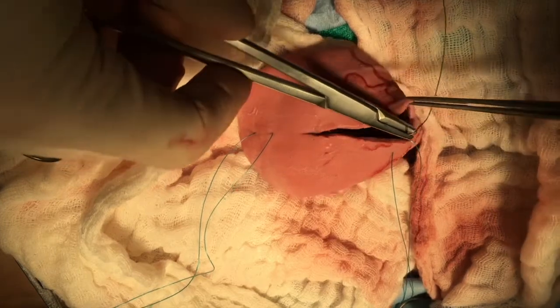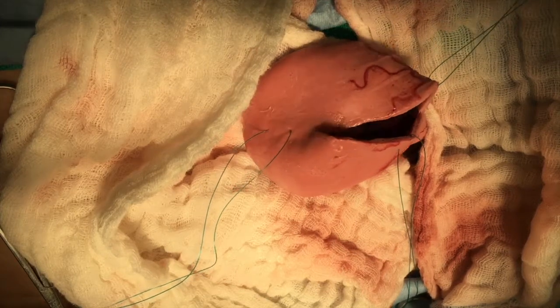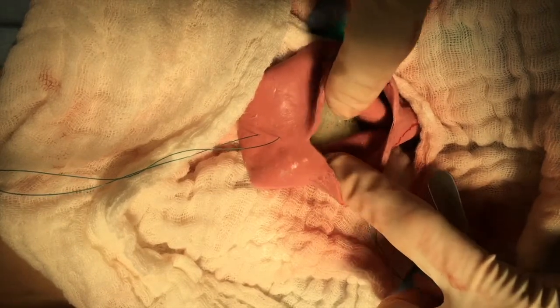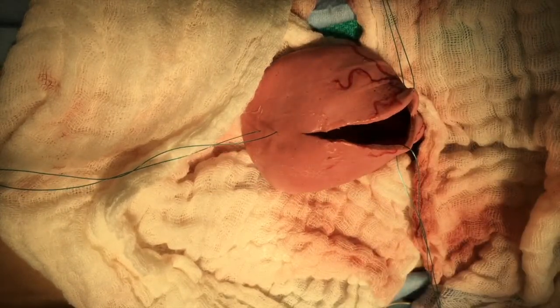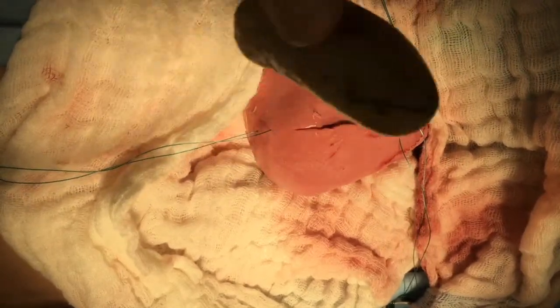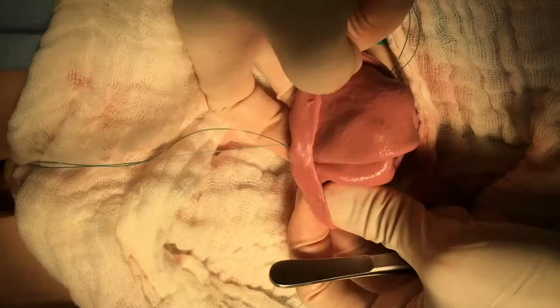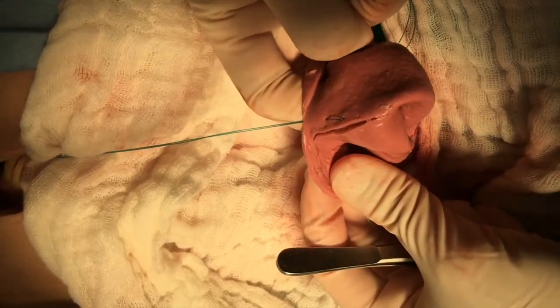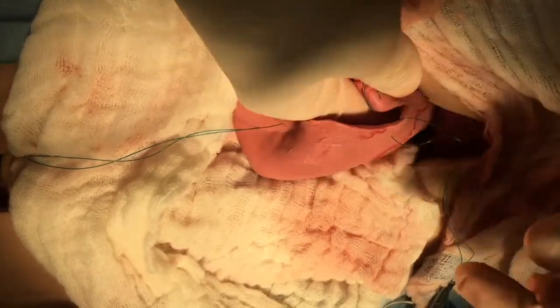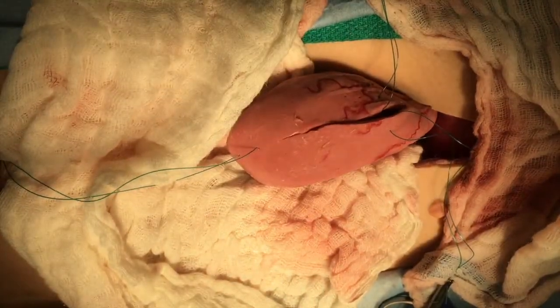By manipulating these stay sutures, we can get a good look and feel inside the bladder lumen. In your specimen there will be some stones that need to be removed — of course you may have more than one. You can completely evert the mucosa and check all the creases and crevices of the lumen. Also want to palpate down towards the neck of the bladder.